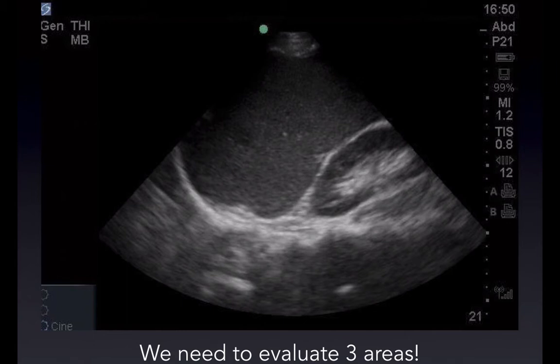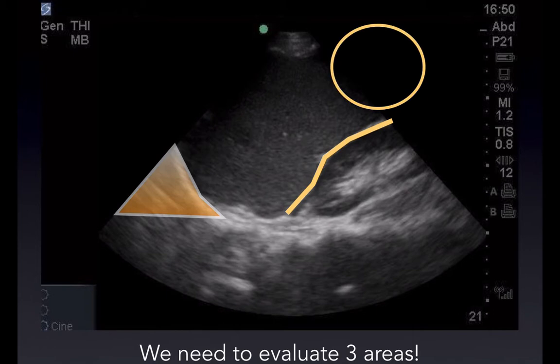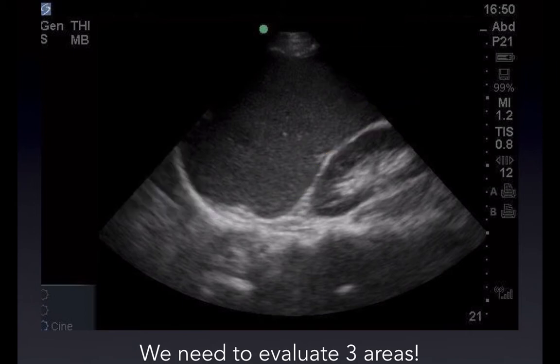And when we look at the right upper quadrant, I just want to make the distinction that we need to look at three main areas. We're looking at the hepatorenal space, but we also want to look at the chest and at the paracollic gutter, because we sometimes see fluid very prominent in the hepatorenal space, but we could have a hemothorax, or we can have a small amount of fluid just in the paracollic gutter.